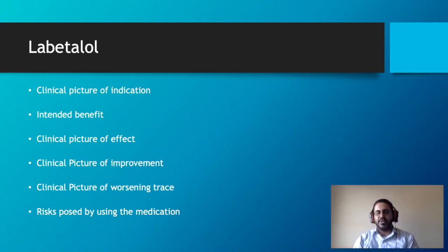And the first thing we're going to think is, is this rise because of the labetalol wearing off, or is this because baby's becoming unhappy? We really have no idea what's going on. It can be quite tricky to manage. So you have to look at the entire clinical picture once again to make sure that you're not missing a hypoxia that's developing and not confusing it with just the labetalol wearing off. Does that make any sense?